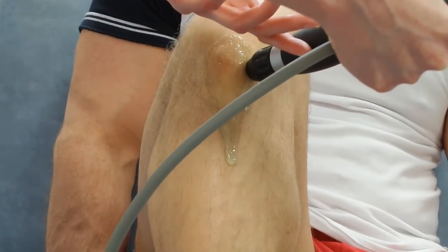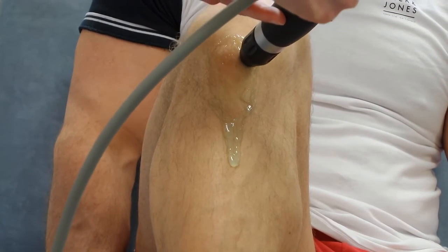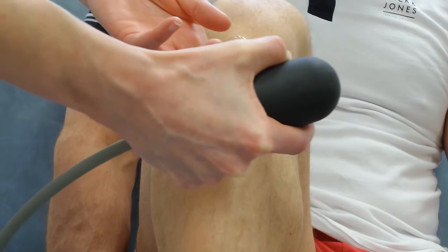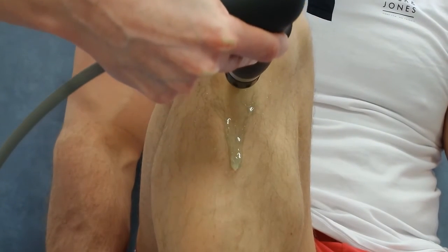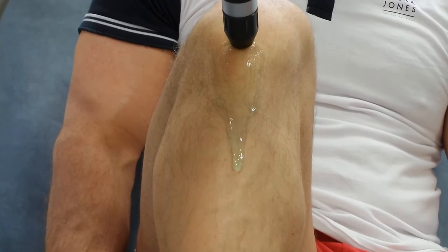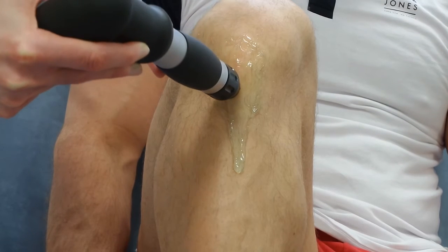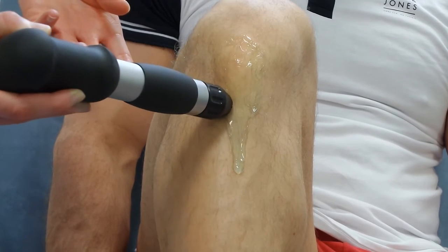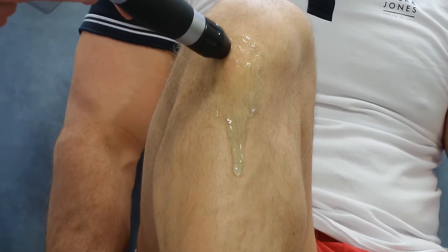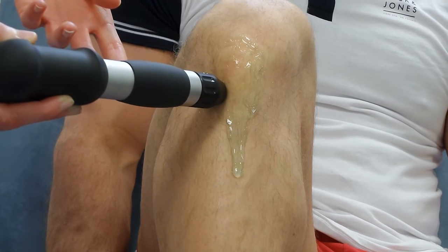As you can see here, the therapist is moving the shockwave around the Osgood Schlatters. Areas which are much more painful than others. You can see that by the patient's reaction. Just keep moving around. The actual area of bone growth is far too big really to do in spots, hence why this treatment isn't a spotted treatment.